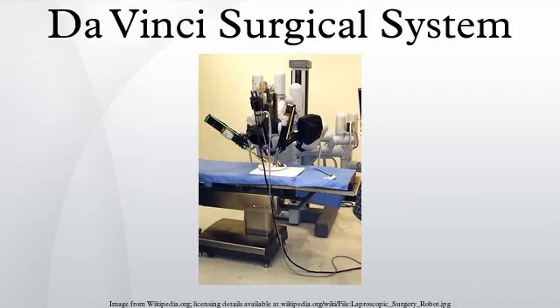According to the manufacturer, the Da Vinci system is called Da Vinci in part because Leonardo da Vinci's study of human anatomy eventually led to the design of the first known robot in history. Da Vinci robots operate in hospitals worldwide, with an estimated 200,000 surgeries conducted in 2012, most commonly for hysterectomies and prostate removals. As of June 30, 2014, there was an installed base of 3,102 units worldwide, up from 2,000 units at the same time the previous year.